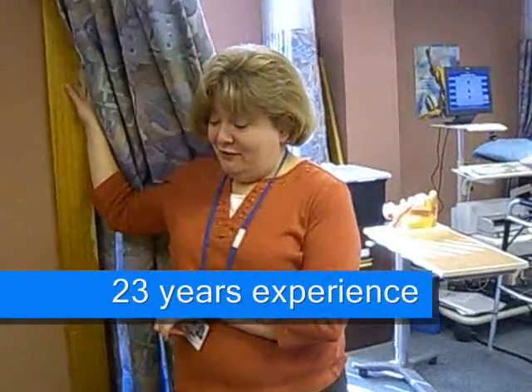He's already building up some muscle, which is one of the reasons that this is already his second socket. A lot of amputees shrink down when they get the first socket, because they've had a lot of swelling if it's soon after their surgery. In Mark's case, he didn't have as much swelling when he got this socket, but he built up some muscle, so he actually needed a bigger one, not a smaller one.